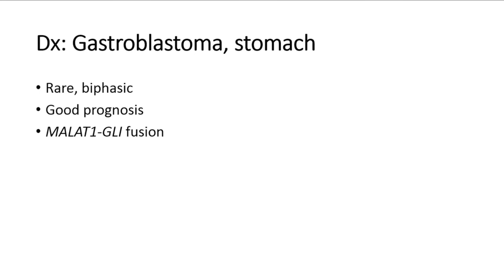And this is a gastroblastoma of the stomach. There's, I don't know, 10, 15 cases I've seen in the literature. There are rare reports of similar tumors in the duodenum, but at least those we can call duodenoblastoma. Have not seen one of those. Despite the fact that you might think this is a bad actor, it's a blastoma, it's primitive, it doesn't look terribly ugly, although there was all that ulceration overlying it. These patients do have a good prognosis. So if you ever happen to see one, and I certainly don't anticipate having one naturally cross my desk during my career, you can at least say that the patient is likely to do well.